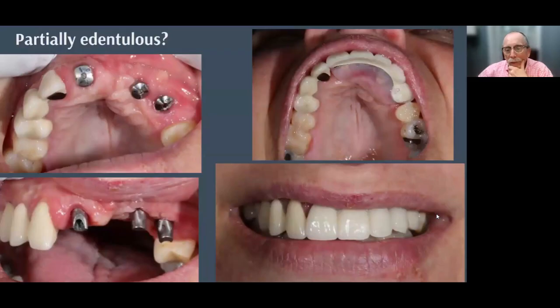Didn't do a ton of these, but it makes sense that if you've got this edentulous space, there's a lot of bone loss, and the common workflow would be, let's do a crown and bridge case here, implants, do some bolted down crowns. But what are you going to do about the gum? All right, you're going to use pink porcelain. That's a challenge, right? Making it look good, and then when you get it there, it's got to be cleansable.